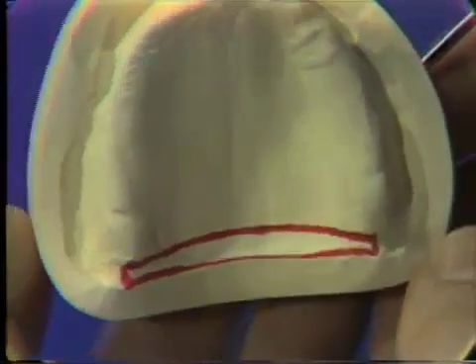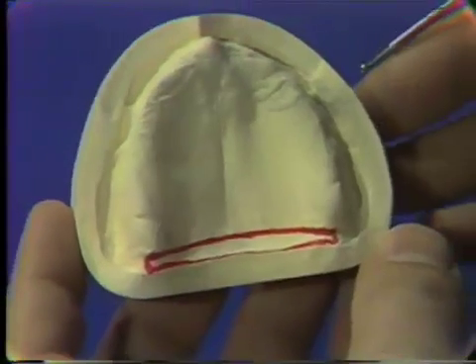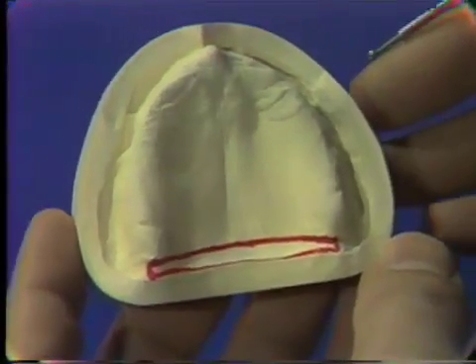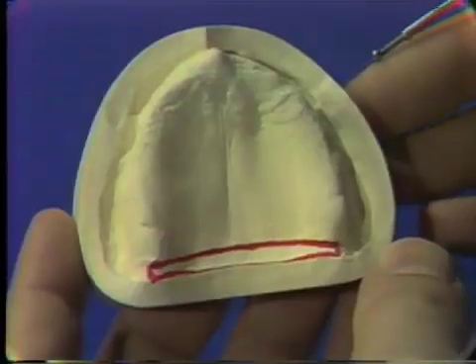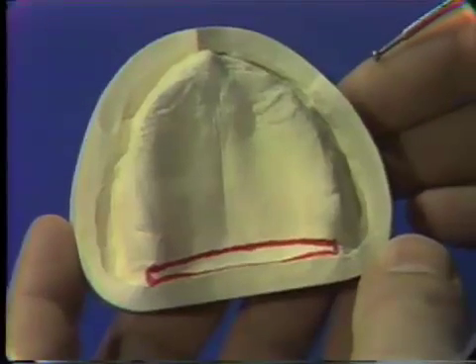After this has been completed, the maxillary base plate can now be fabricated.